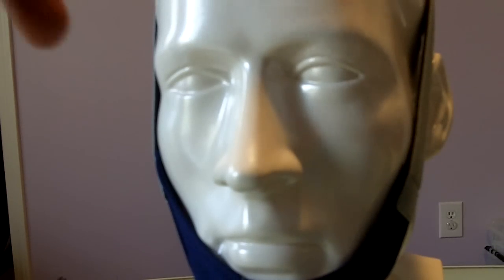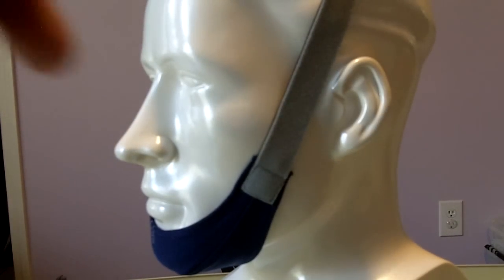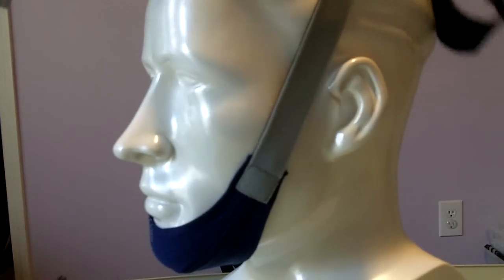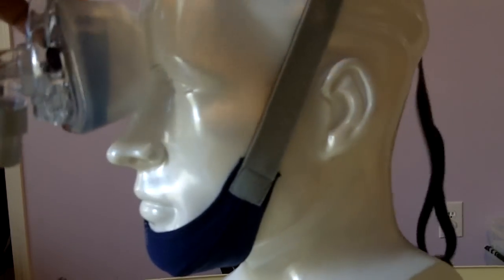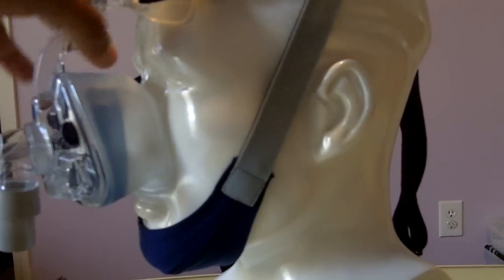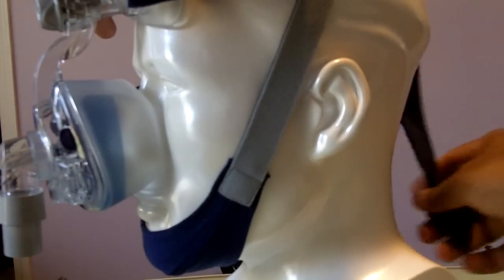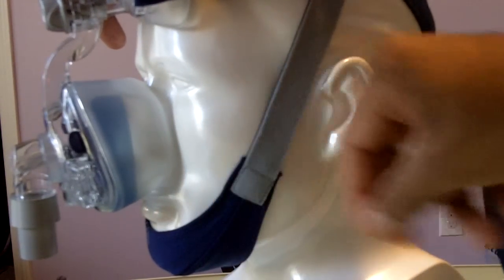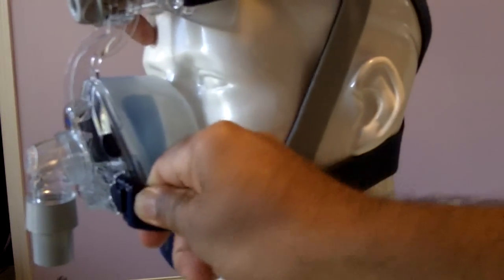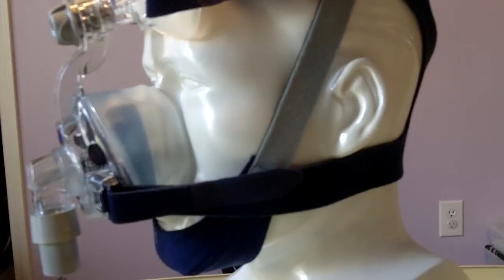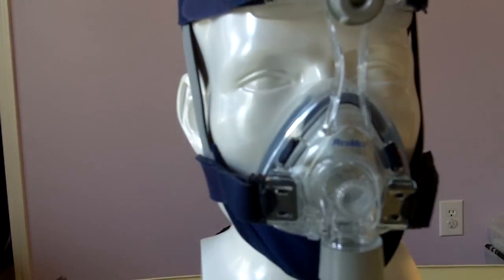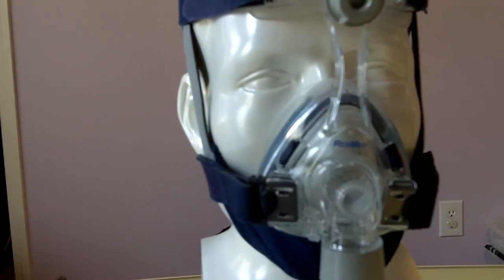Put your chin strap first and then put your headgear, your CPAP mask headgear on. This will keep it in place a little bit better.